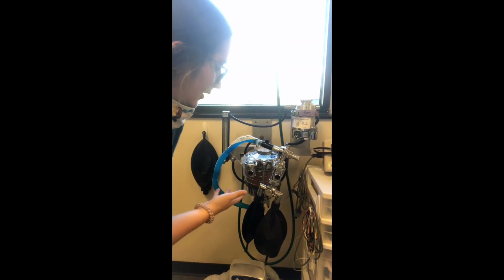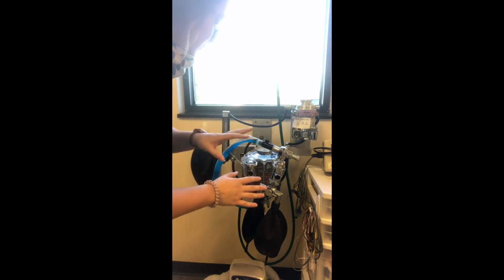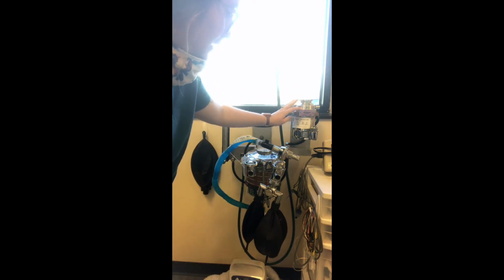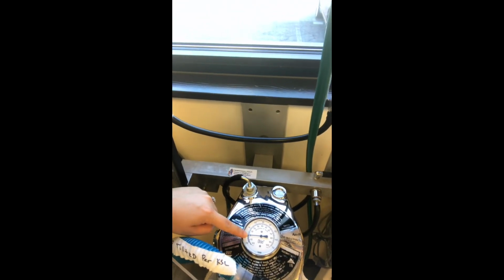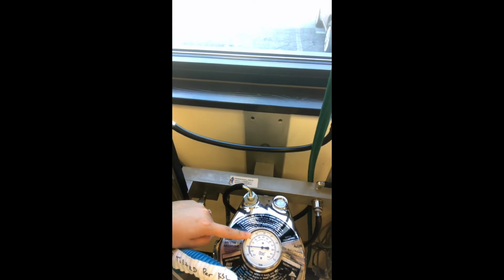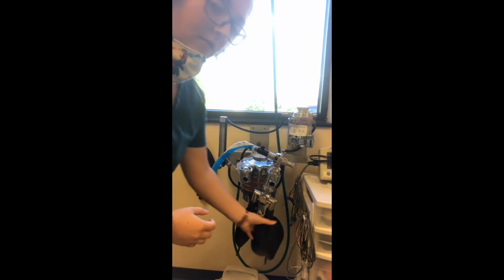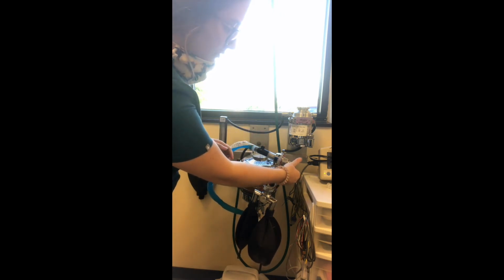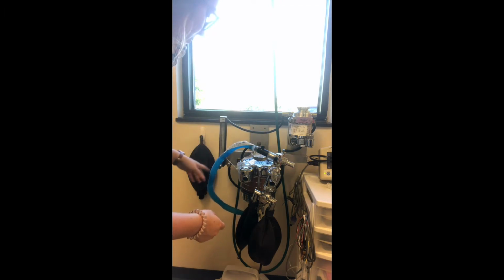So this is one of our anesthesia machines. All of the parts on here I'm going to describe to you. This is our vaporizer. We use isoflurane. Then we have our pressure gauge here that would go up with any kind of increase in pressure from the lungs or anything like that. Then we have our reservoir bags down here. We have our pop-off valve that can also be screwed in, but we have just our finger pop-off valve.